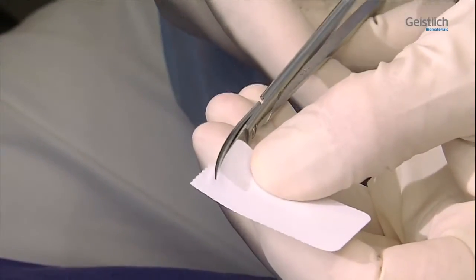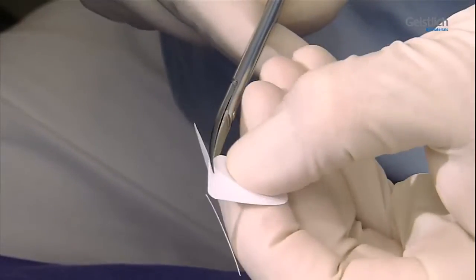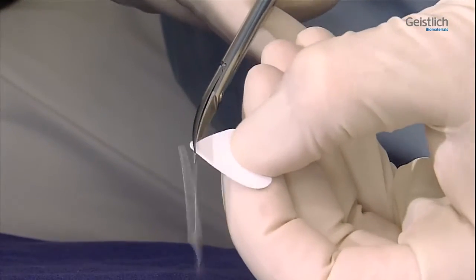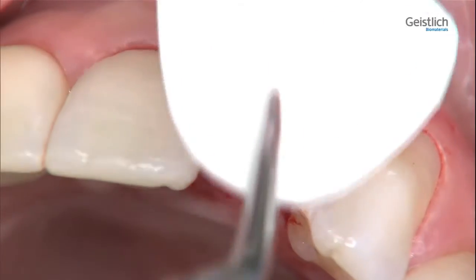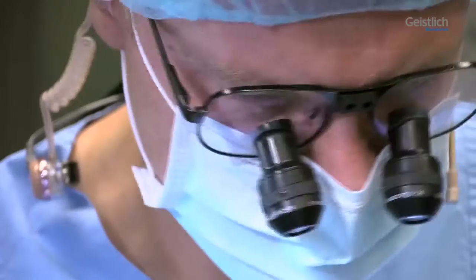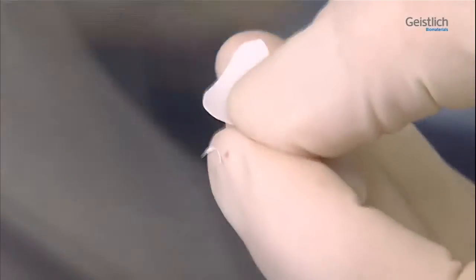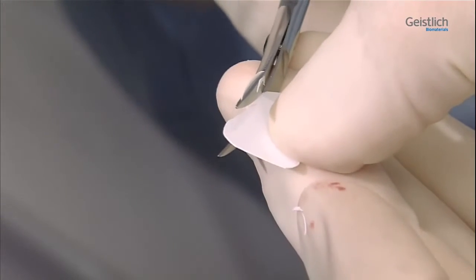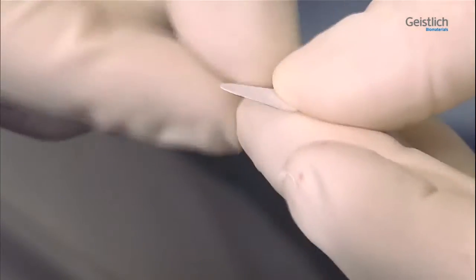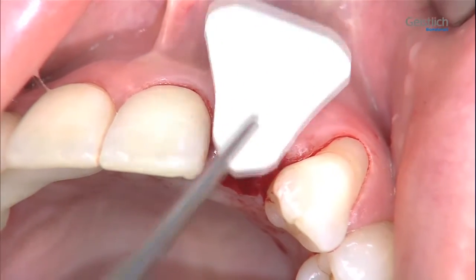We then cut a template for the membrane from a sterile sheet of paper. The sterile template is best cut with curved scissors. To check the shape and size match, the template is held against the outer side of the defect. In a further step, the contours of the template are refined. The membrane must overlap the defect region both mesially and distally, and should rest on the adjacent bony structures, ensuring a good crestal seal of the socket.